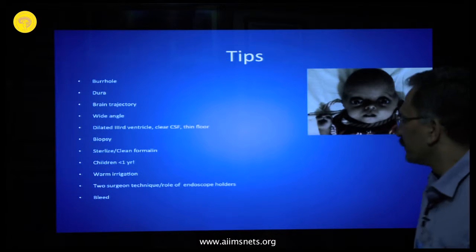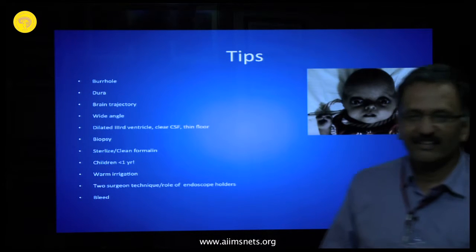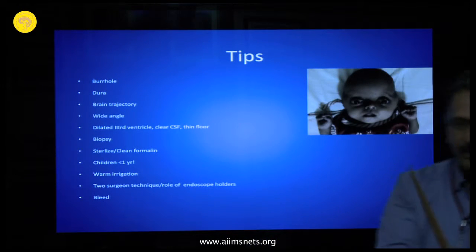It's a small thing. And the other very important thing is the angle of the camera. You can change the magnification. What happens sometimes is that if you don't make the angle wide enough, then you don't get an overview. And when you are uninitiated into this endoscopy business, with a heavily magnified view, you may go inside and cause damage. So just make sure that you have a relatively wide angle of the camera. You can easily adjust that. The small things, you completely forget about them.